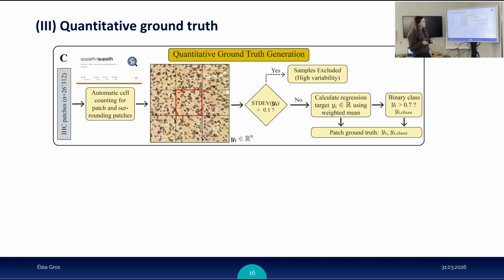There is a built-in tool in QuPath that allows you to generate very small machine learning models which perform good enough for this kind of task. Here in red we have the cells that are marked as positive, which are tumor cells, and in green you have the negative cells, which are just normal cells, such as blood cells or white cells, that are present but are not tumor cells.